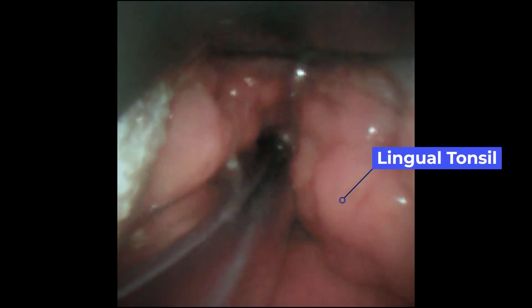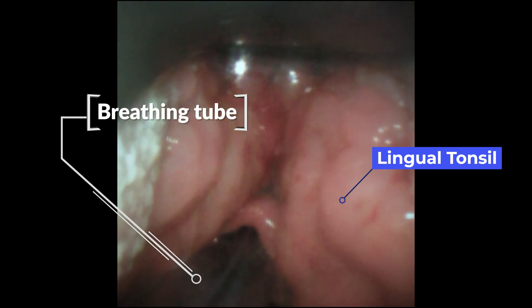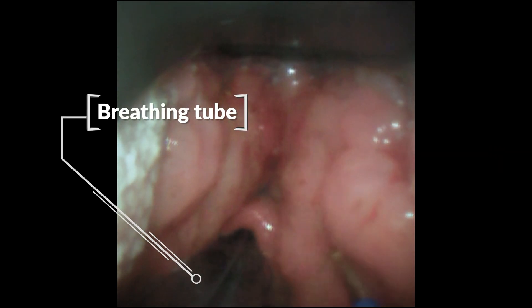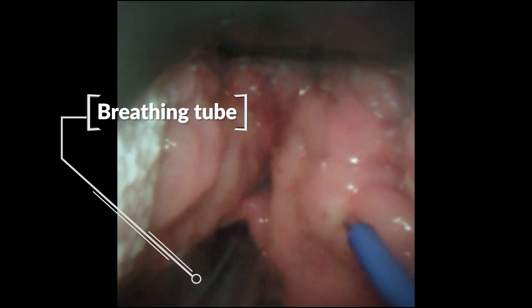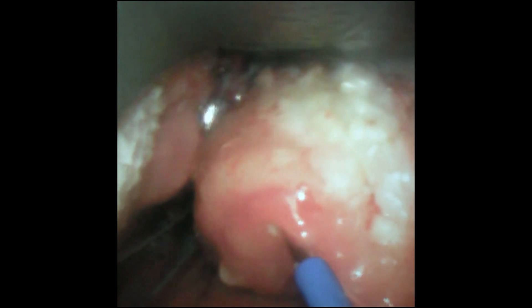I want to apologise for the rather poor picture, but you should be able to see that there is an awful lot of tissue on the back of the tongue which is blocking the airway. On the right you will see the radiofrequency needle, which will start ablating the lingual tonsil on the back of the tongue. As you can see, it slowly causes the tissue to go white in appearance — I have sped up the video to make it easier to watch. I will slowly ablate the whole lingual tonsil on both sides, making sure I do not go into the sensitive muscle of the tongue. By avoiding this muscle, you can avoid most of the serious side effects of operating on the tongue. Because this is only a superficial technique, only treating the tonsil tissue on the back of the tongue.